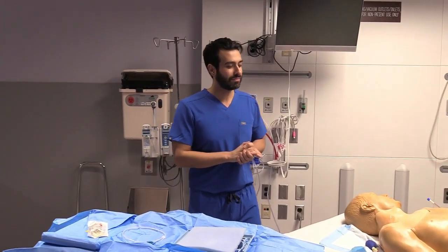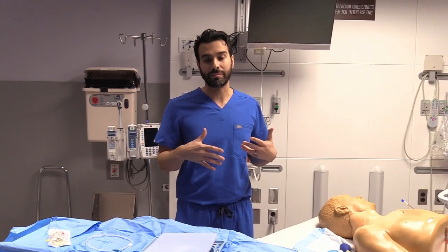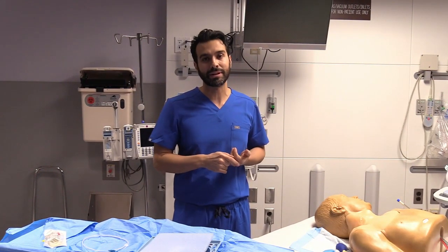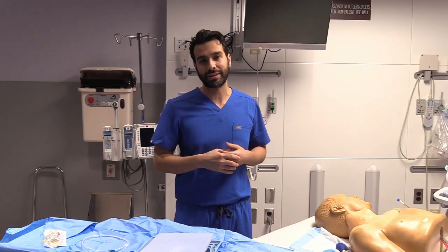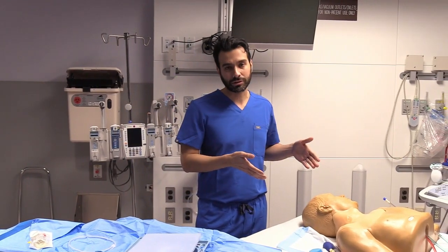So the basics of this is going to be for placement of central lines, and we want to be able to make a video so that everybody can review both the indications for it and then placement of the catheter, and then also understanding some of the nuances of placement of the catheter itself. So most of us will be placing right internal jugular central venous catheters.